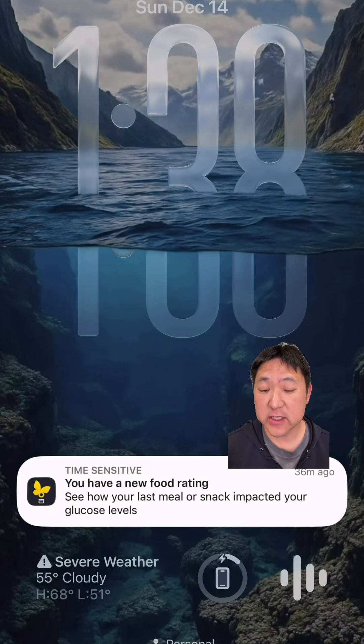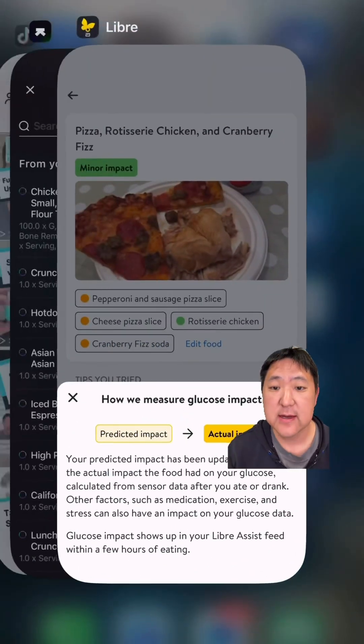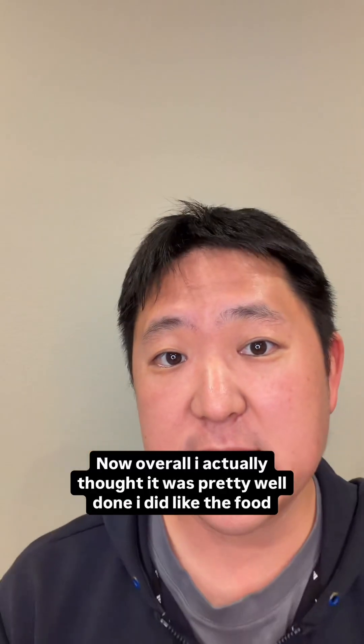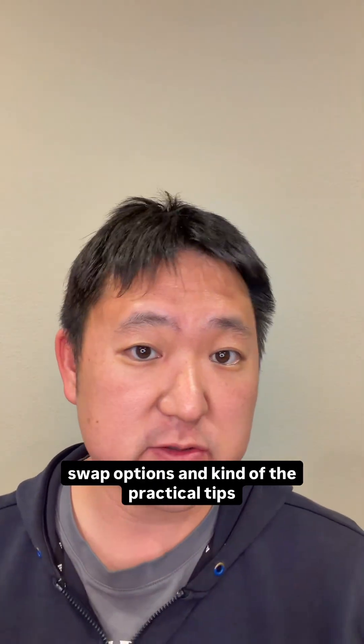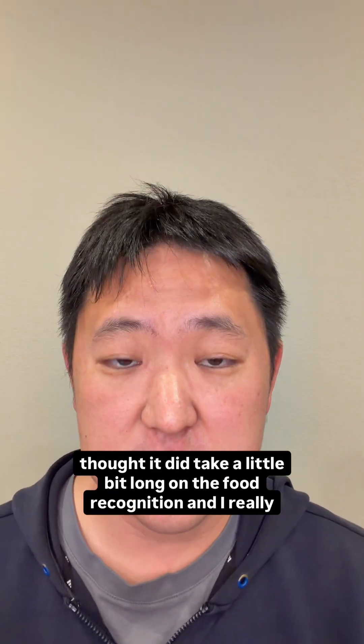About three hours later, I actually got a notification that there was a new food rating. When you tap that, it shows that they adjusted the impact it actually had on your glucose. Overall, I thought it was pretty well done. I did like the food swap options and the practical tips. A downside was that the food recognition did take a little bit long.